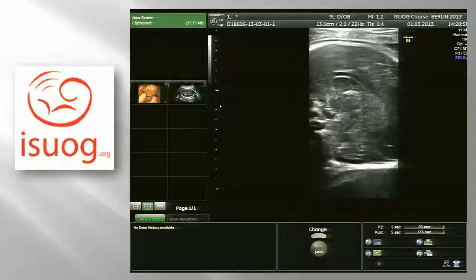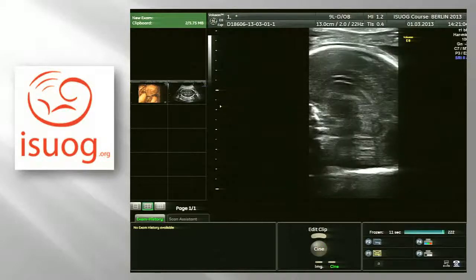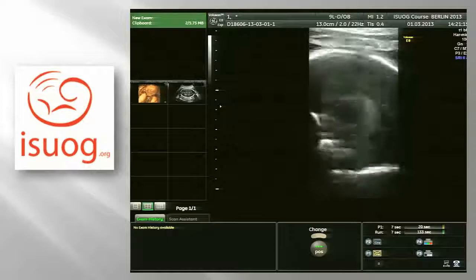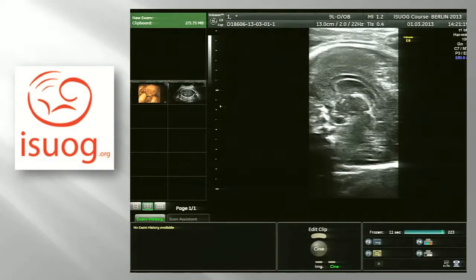Go a bit more behind. Like that, yeah. A little more horizontal. No. No, remove, I continue. More behind. Yes, it's difficult to push too much. This is a vermis. Yeah. I will save the picture after.